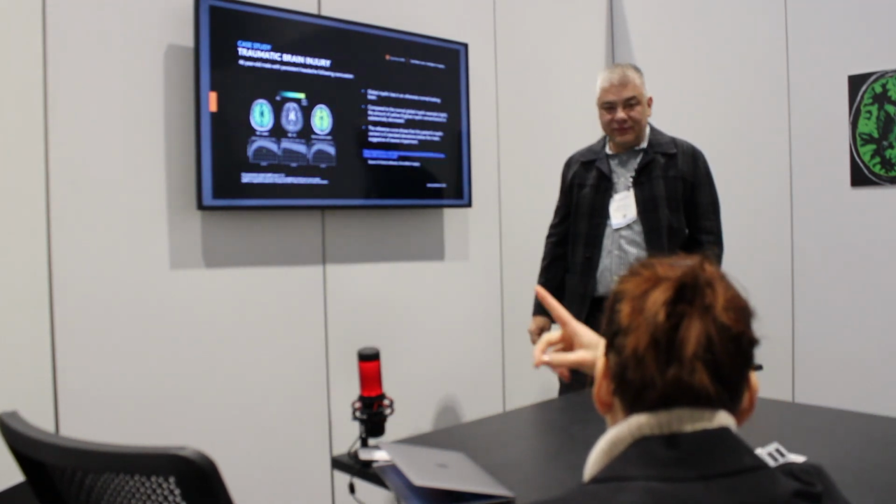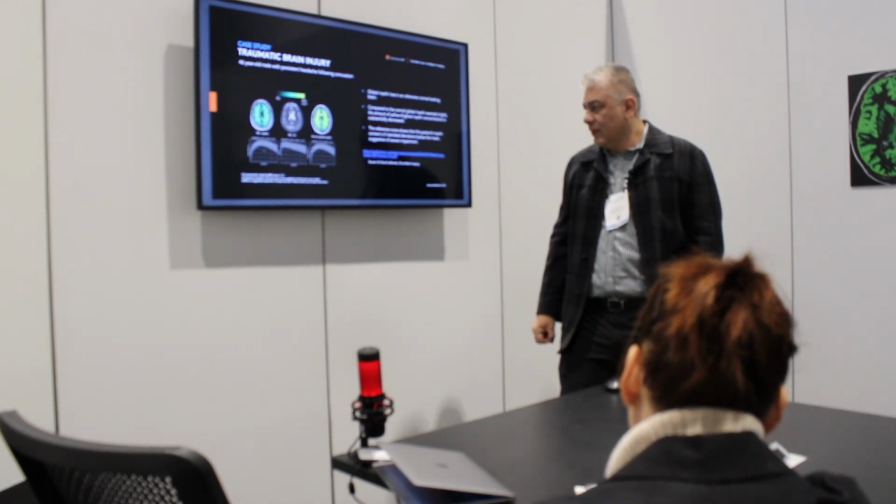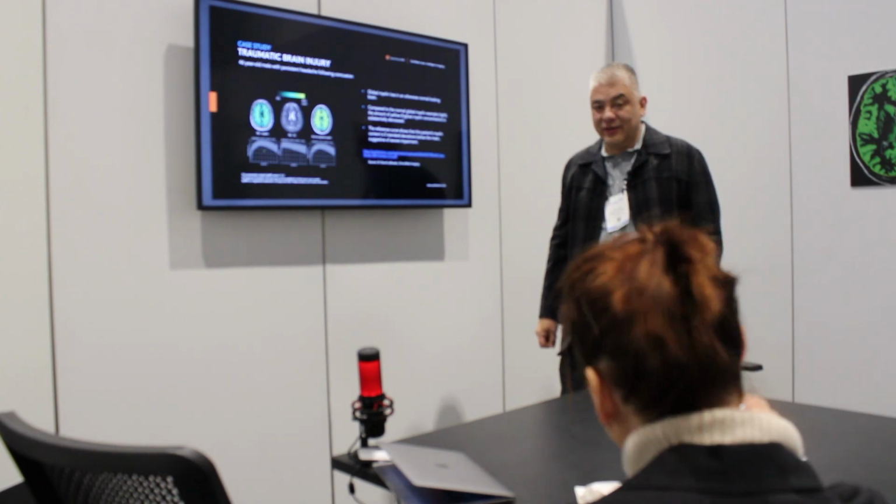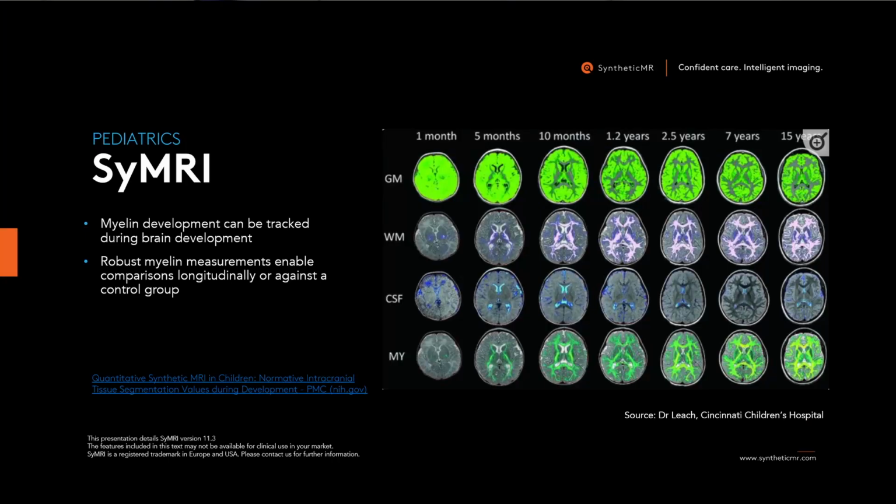Do you recall the SWI in this patient? Yeah, it didn't show anything. Didn't show anything? It didn't show anything. Seriously? Yeah, the article is there. It didn't show anything. So it's showing that it has multiple applications. That's something very impressive. Some very general, and all these published and validated.